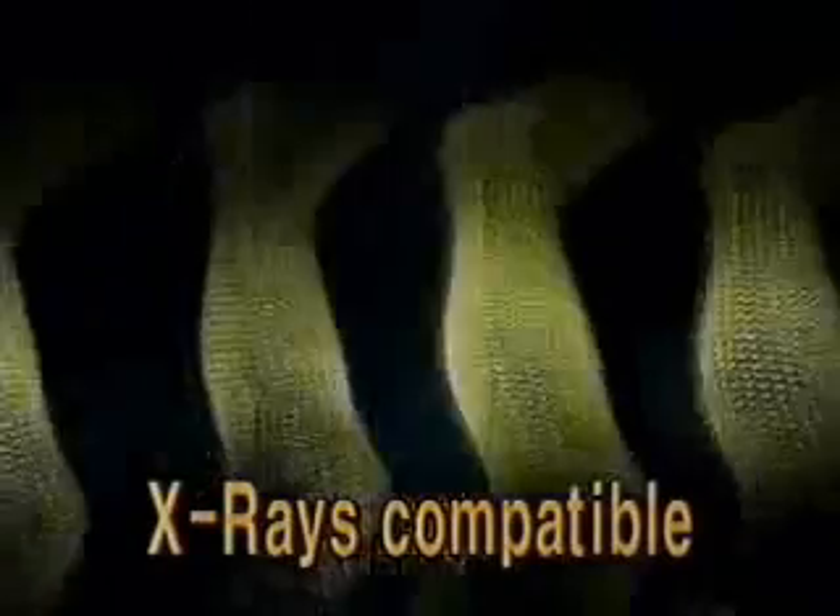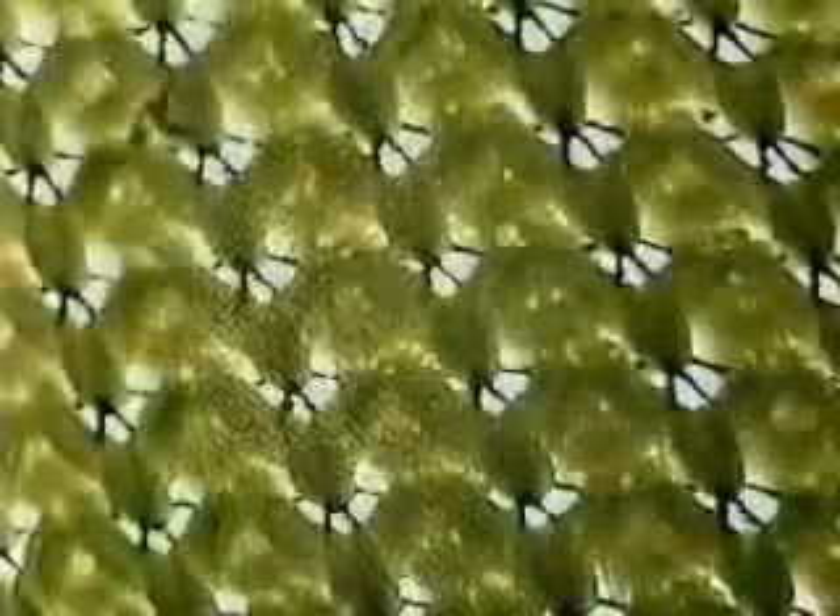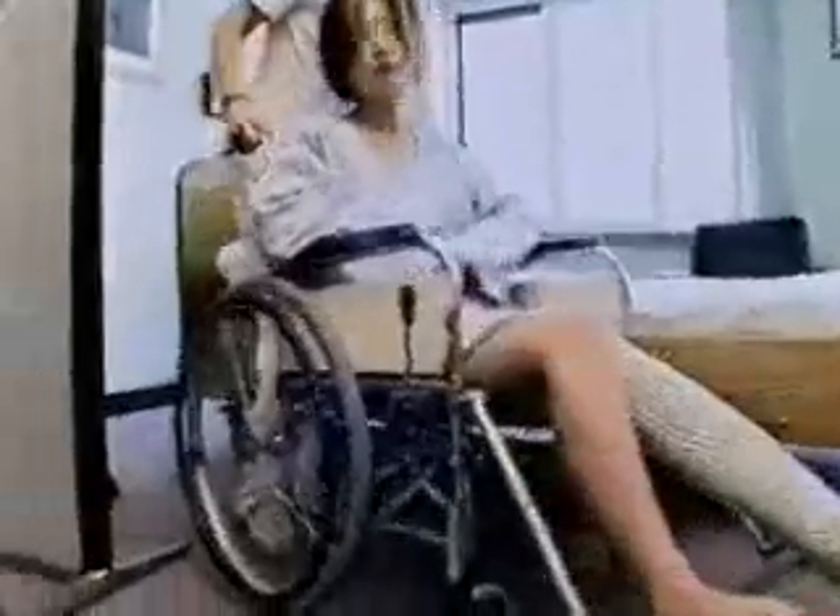Casts of the past had to be removed before taking x-rays. With the HM cast, it is no longer necessary. The HM cast allows x-rays to be transmitted through it, making it easy for doctors to frequently check the progress of the healing bones. In addition, it allows for a proper setting of bones and reduces the cost of additional casts.